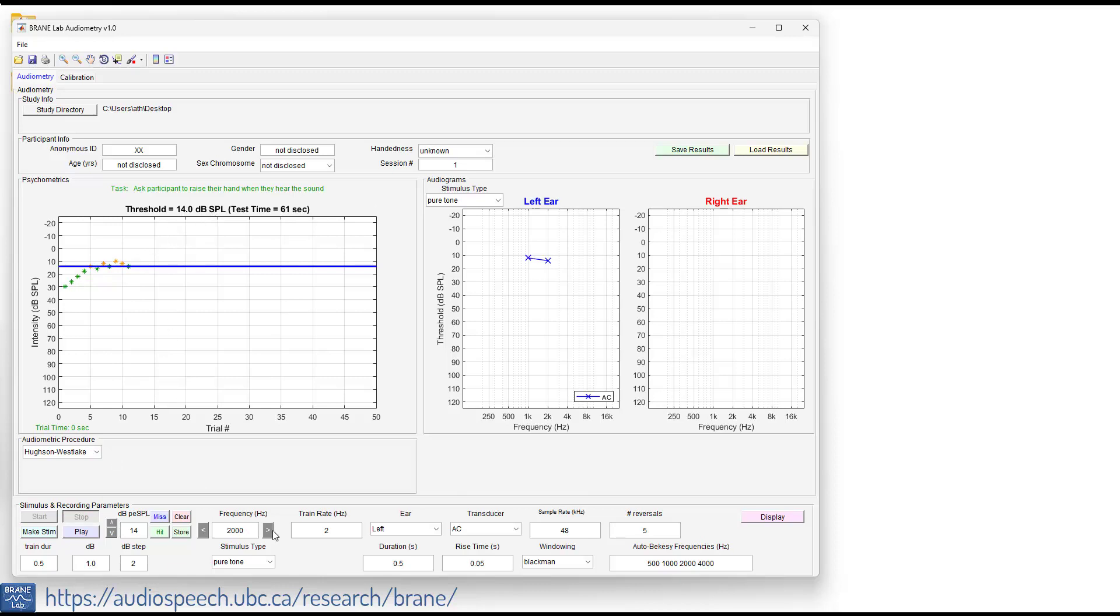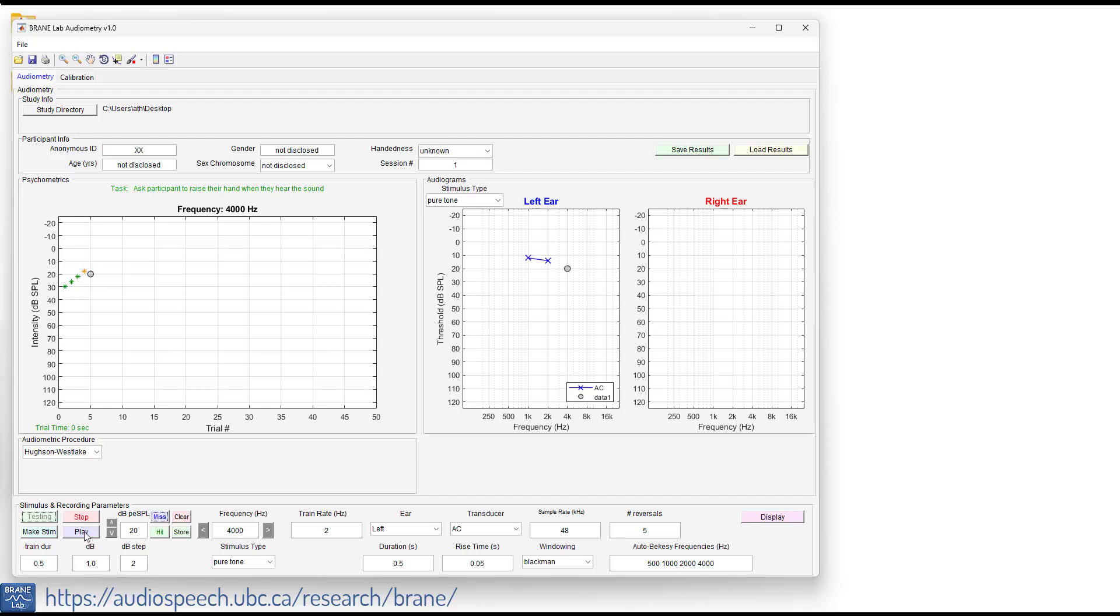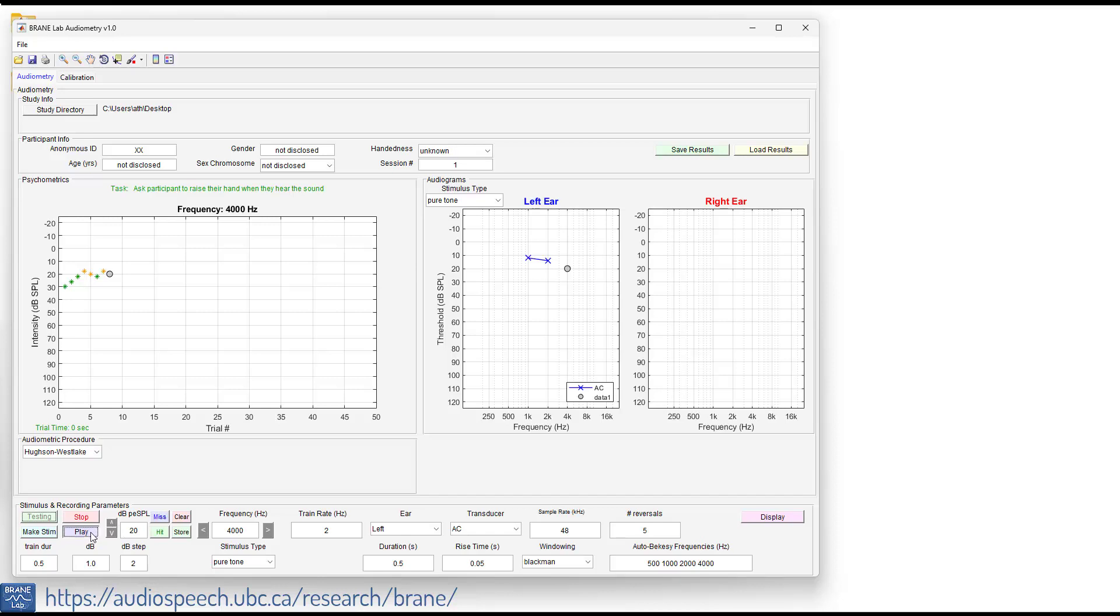So let's go on and we'll do the 4000 Hz. Make stimuli. I'm going to start at a level of 30 again. Press play. Yep. No, I did not hear that one. So I heard it to ascending, store and then stop.